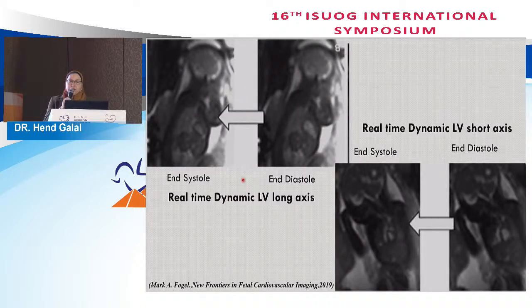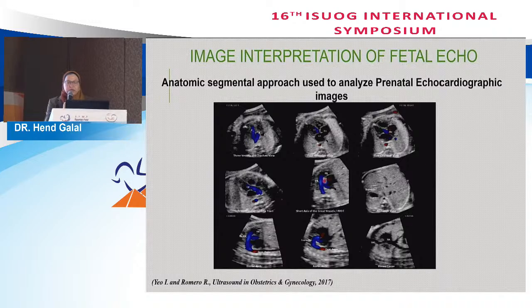As regards the real-time or dynamic sequences, we can see how it differs between systolic and diastolic view, either in long axis or in short axis view. So we can use it as a functional determination or for quantitative images.